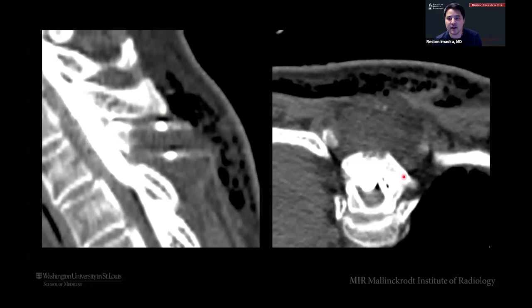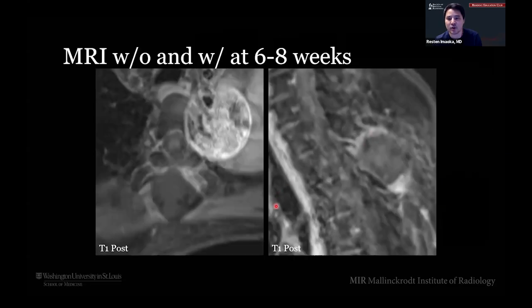Everything is protected. And then this is what it looked like 6 to 8 weeks later. We remember before it was enhancing the whole way through. It's all dead now. And again, this is normal to see. If you guys are reading any MRIs after anybody's doing ablations, it's normal to have this thin kind of enhancement around it. You just don't want to see any of that nodular or mass-like enhancement.